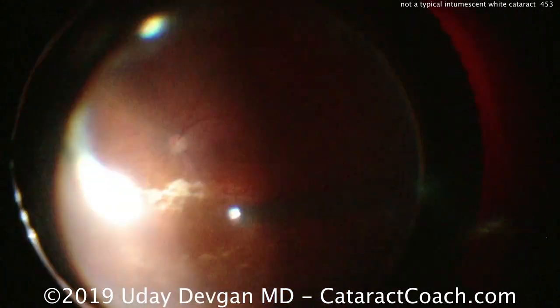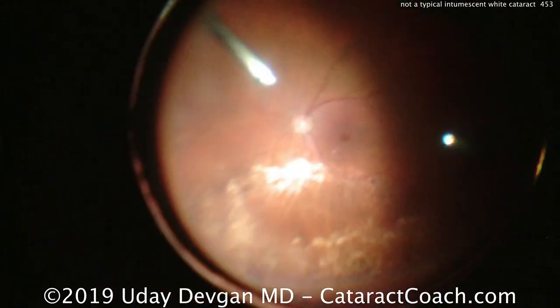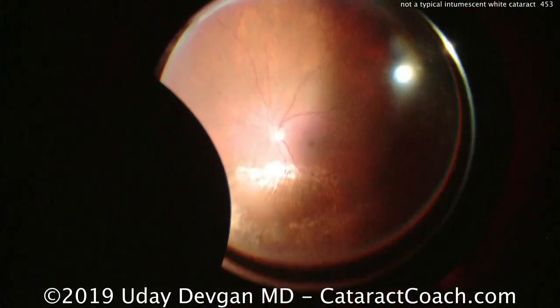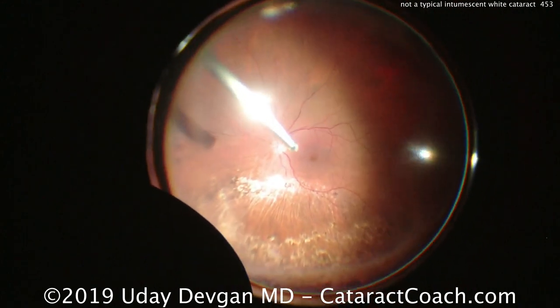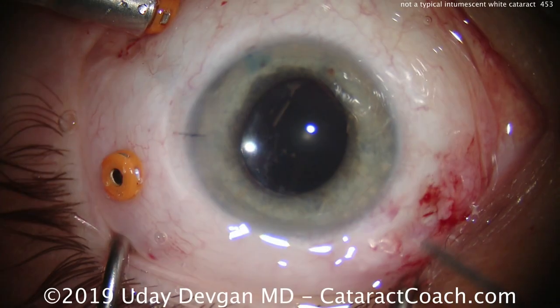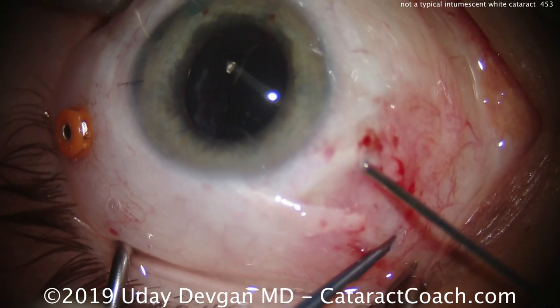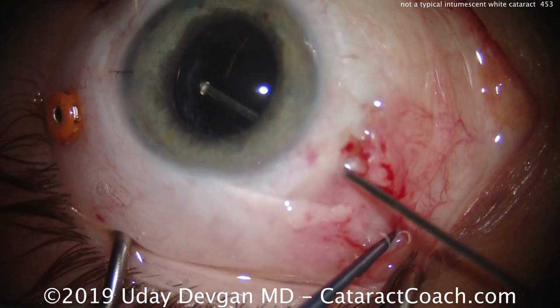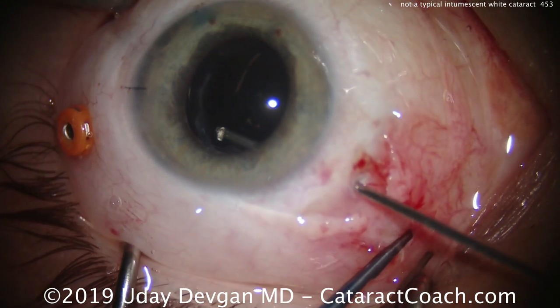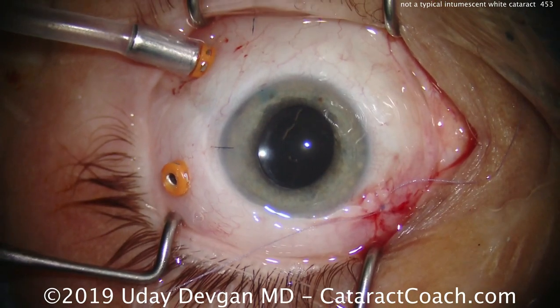Cleaning up everything nicely here — shaving off any remaining vitreous that may have been left from the initial surgery, especially at the vitreous base and where the lens was. That looks really clean. This patient is going to have a beautiful outcome. You can see a lot of laser that was done at the site of the prior detachment. Going once with the vitreous cutter behind the IOL to clean up the posterior capsule — remember, the IOL optic is captured behind the anterior capsulorrhexis, so these fragments of posterior capsule are not needed and we don't want them floating in the way.